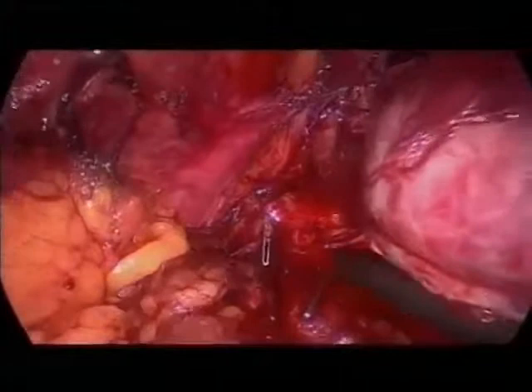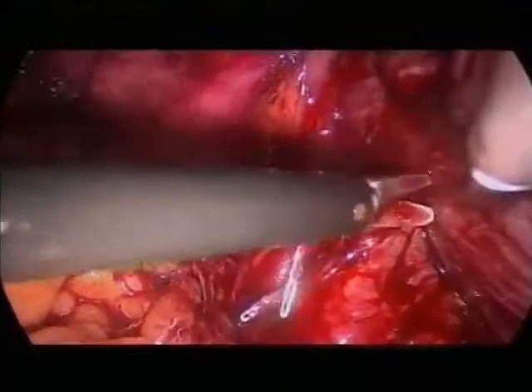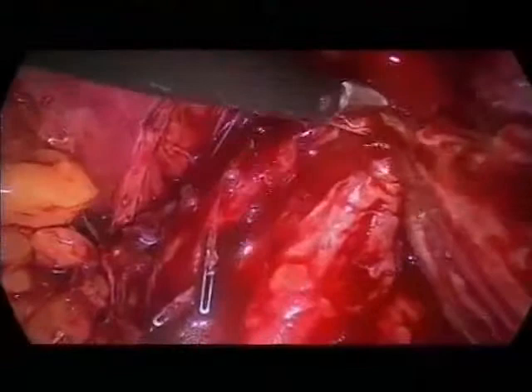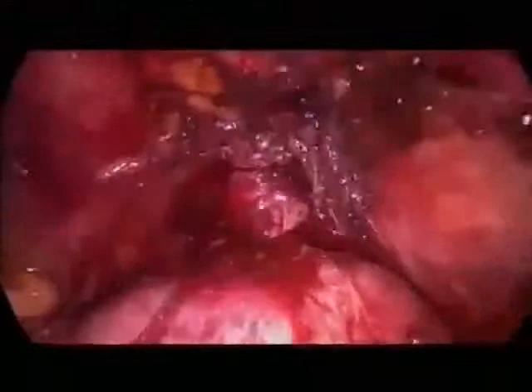Why are you not undermining the urethra and cut through and do a retrograde dissection at this point? It's my feeling it's easier and safer because you have the orientation here of the capsule. Camera in a little bit. And very often you can push it like I do now. I think this point is very important because you have some tongue behind, and if you don't turn the prostate like that, you will have positive margins. You will leave some part of the prostate in the apical region. So turning the prostate is essential, I think.